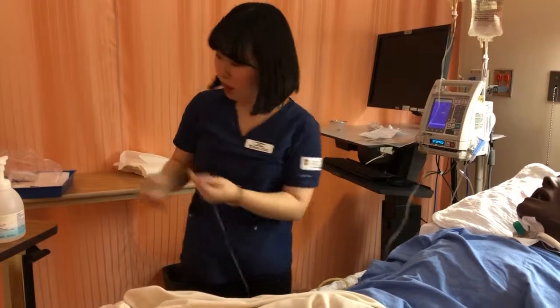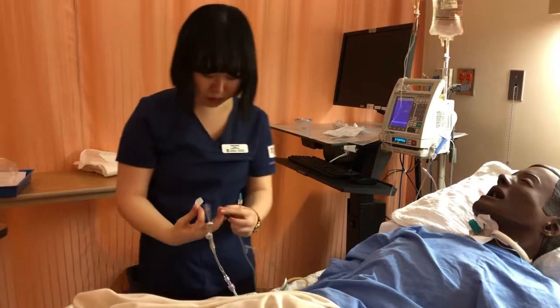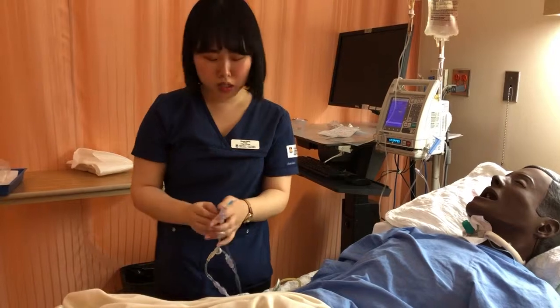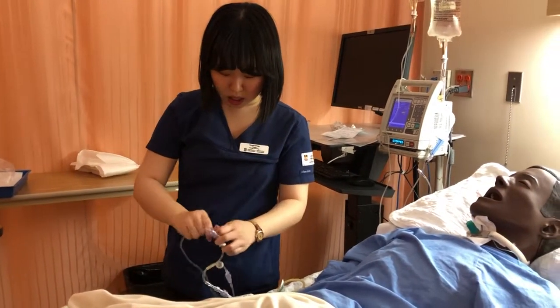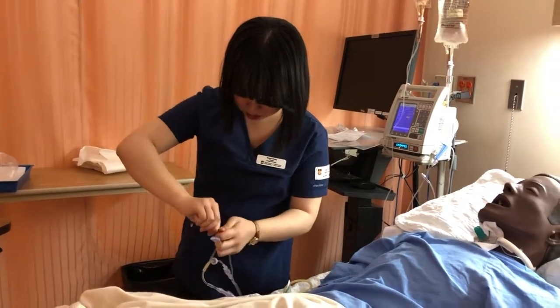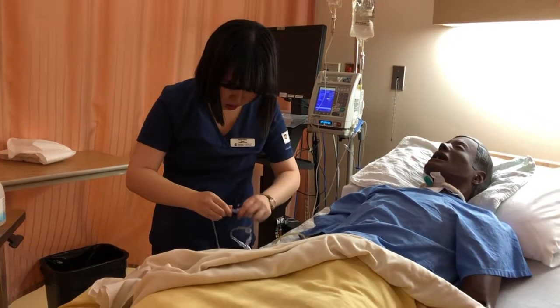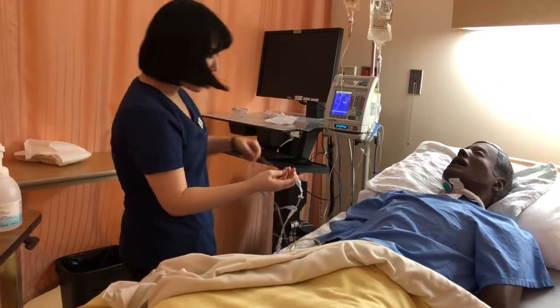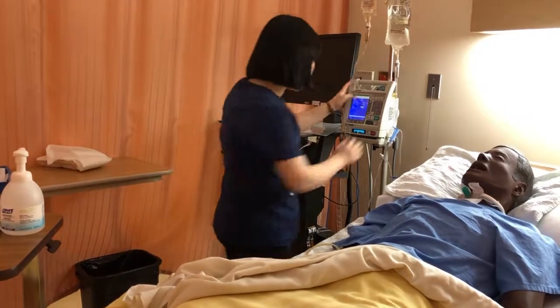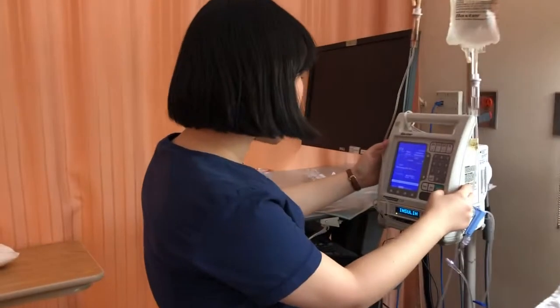So I'm going to make sure I do hand hygiene again, and I'm going to clean the port for 30 seconds and let it dry for 15, and then unclamp. The site is not infected. There are no signs of any abnormalities, so keep the sterility. The patient is not in any pain. And I'm going to go ahead and use the route for the patient, and then make sure the tubing is all primed. And I'm going to confirm primary and press start to begin primary.